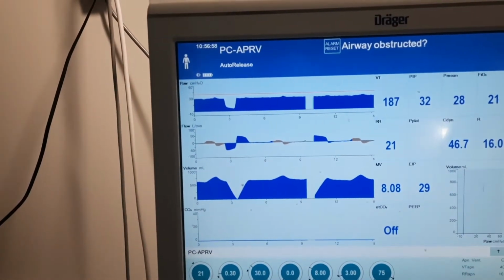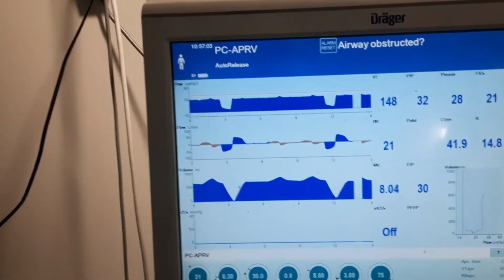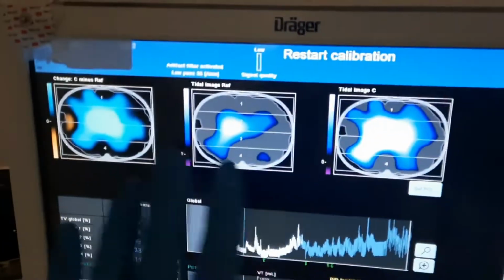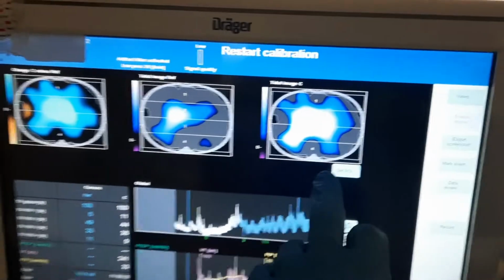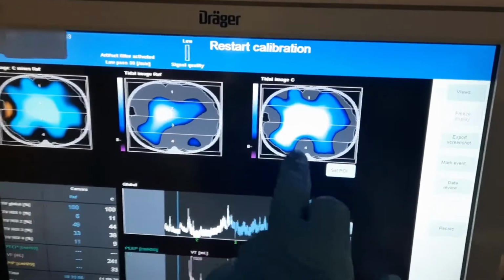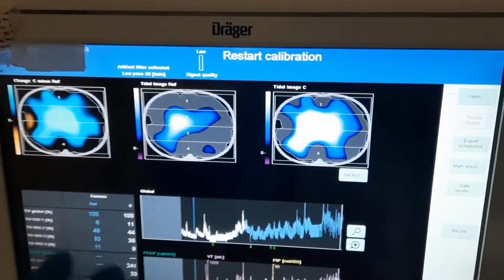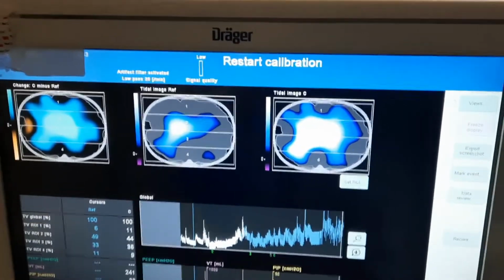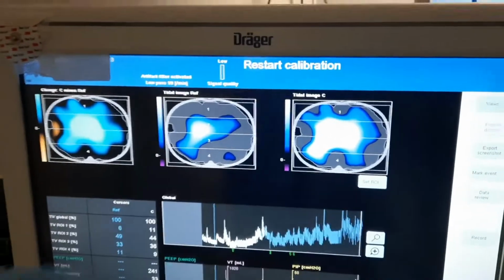So if you optimize alveolar recruitment, and you're looking at it with the EIT, so you're getting information about recruitment here, then the alveolar tidal volume, which is the most important, is more evenly dispersed, the job, the work, the stress, the power, and that means that each individual alveolus has less tidal volume to deal with.